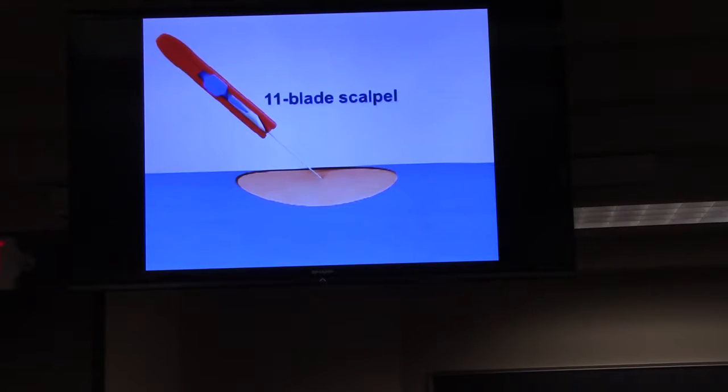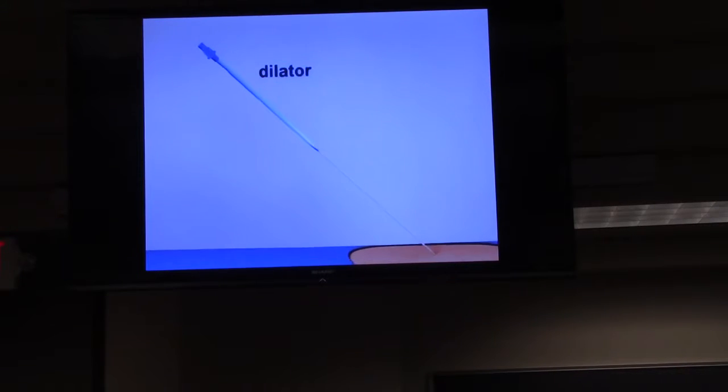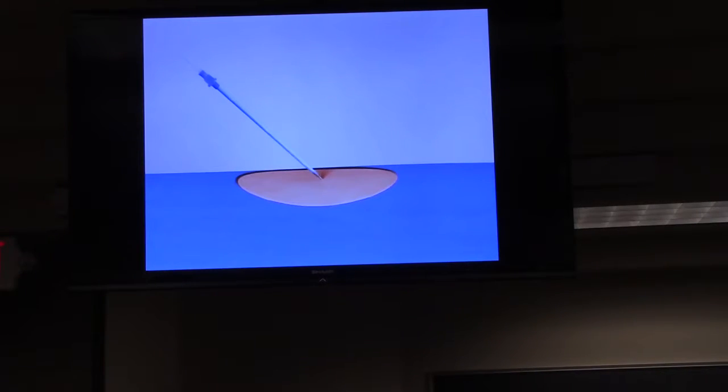Use the 11-blade scalpel to create a small nick in the skin around the guide wire to facilitate passage of the dilator and the catheter. Carefully advance the dilator over the wire and into the subcutaneous tissues with a slight rotating motion, and then remove it.